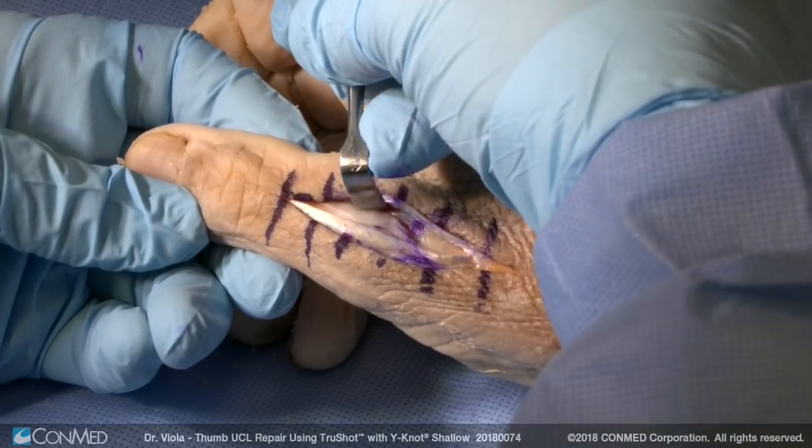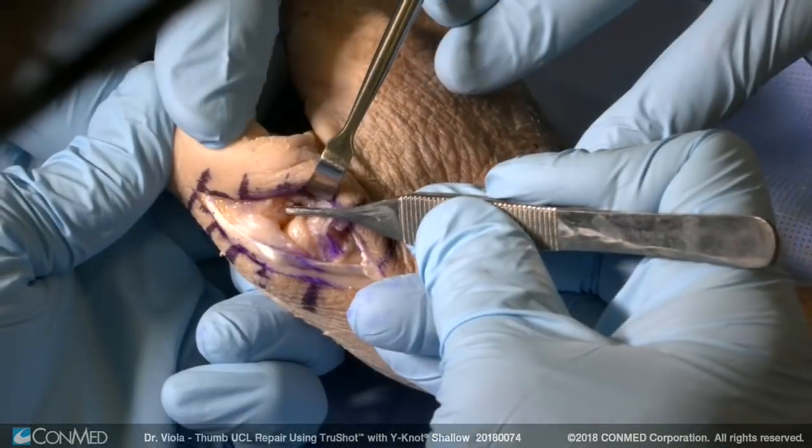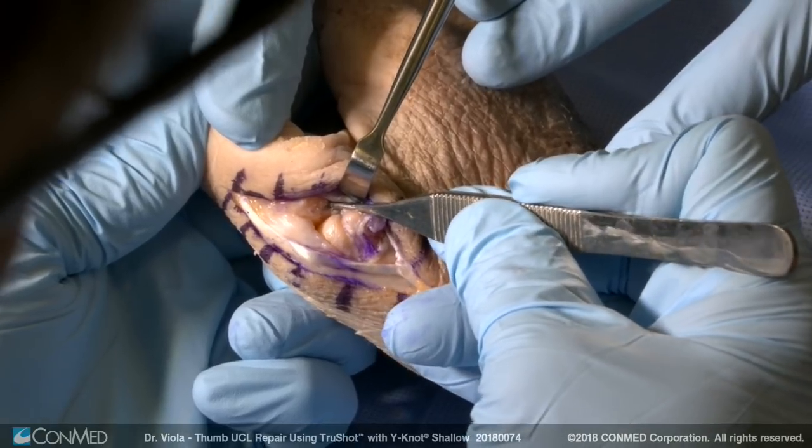We'll retract the EPL and the adductor aponeurosis ulnarly. We've got a complete distal tear of the ulnar collateral ligament. We've got the volar ulnar attachment of the ulnar collateral ligament right here. Here's the volar surface of the bone.